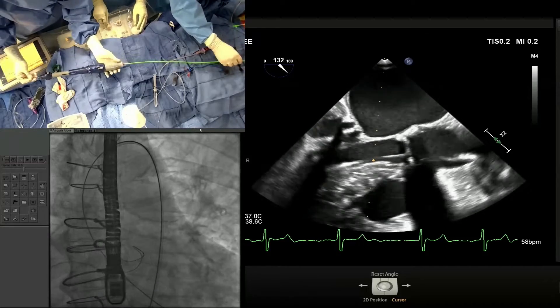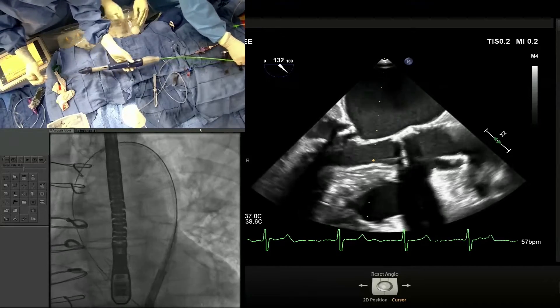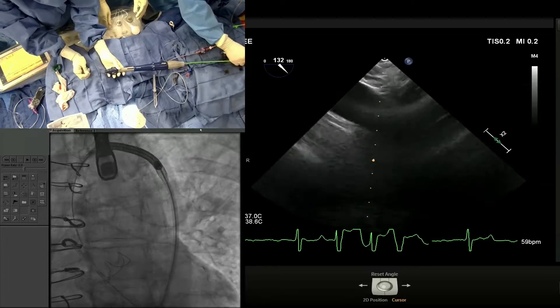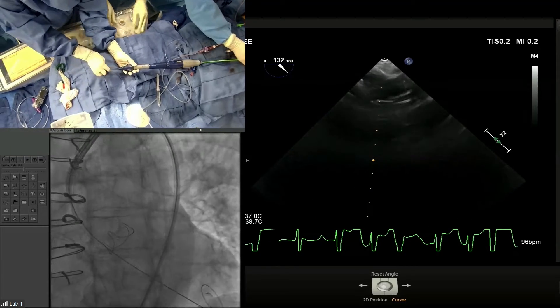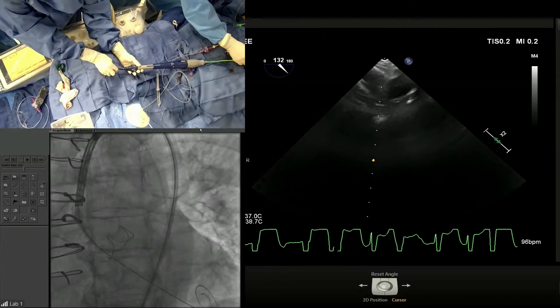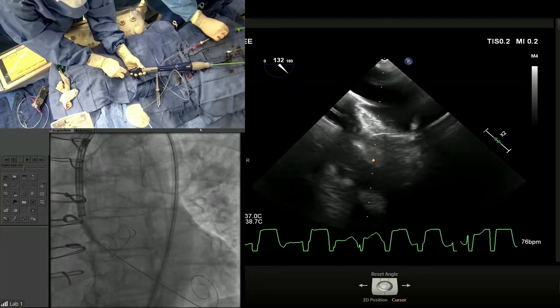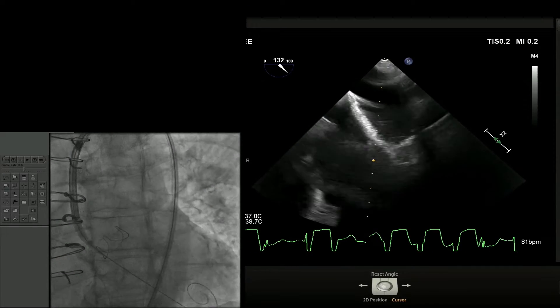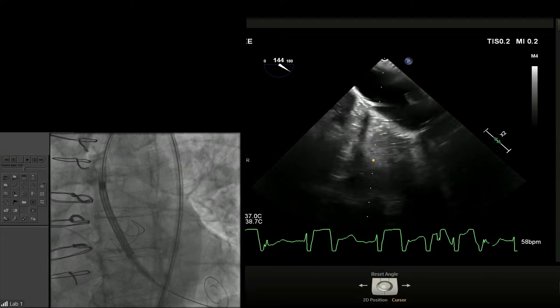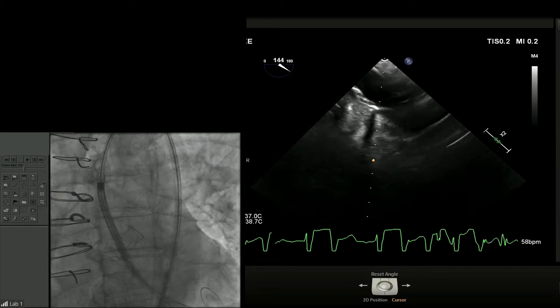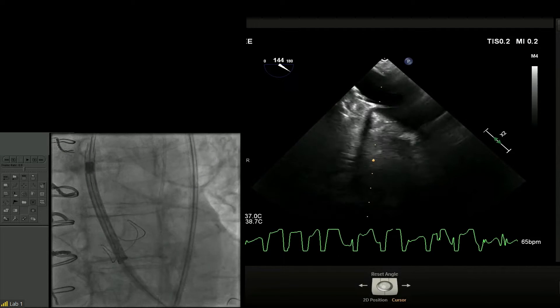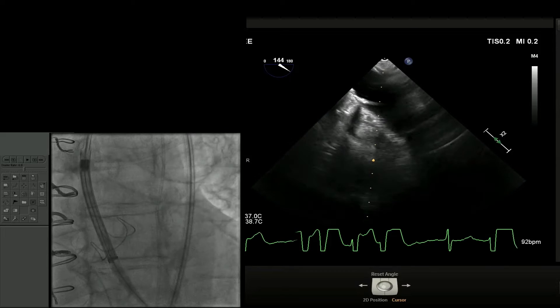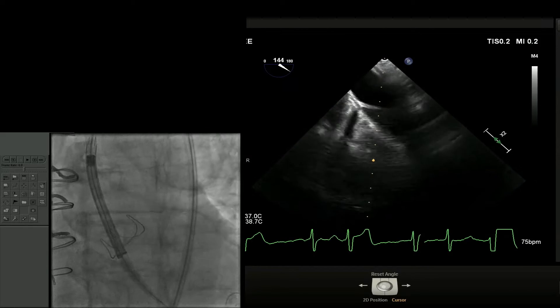We put the Sentinel in — all valve-in-valve cases get the Sentinel. Yeah, everybody gets the Sentinel if anatomy allows. The patient has a Sentinel. You can see it tracks very nicely with the FX system. This actually looks pretty good. There's not much parallax on either valve, which is what you want.